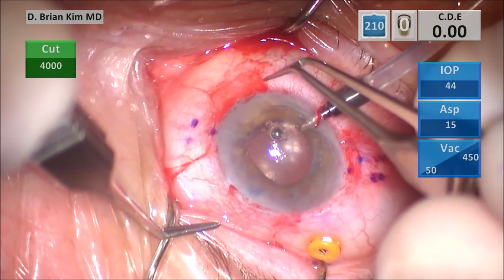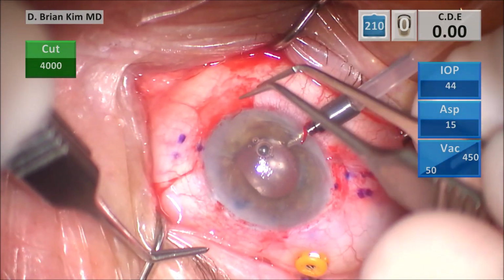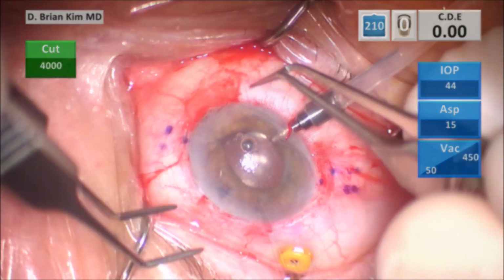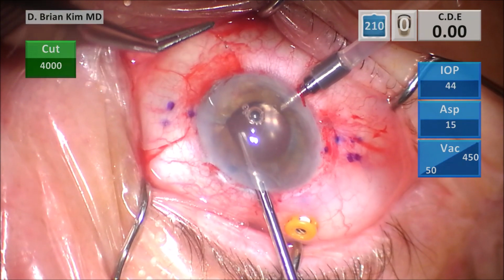and then on the other side with the right hand on the suture on the distal side, I'm pulling. It causes the loop to slide into the eye, and now I've created the pupilloplasty. And then I'm using micro scissors to cut the ends, and that is the extent of my pupilloplasty.